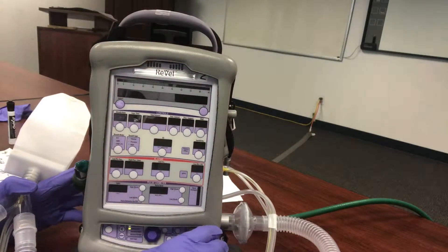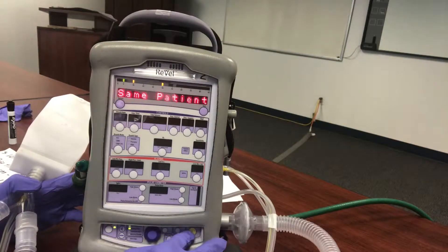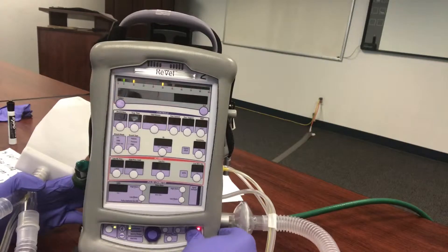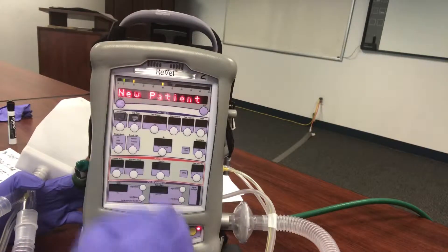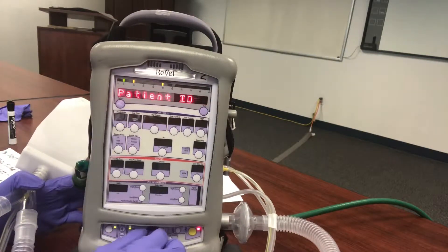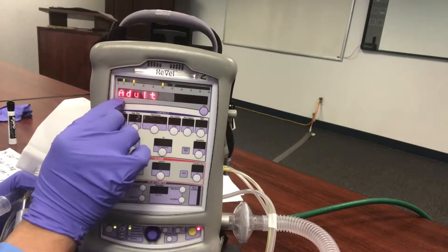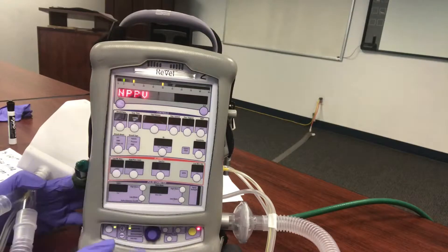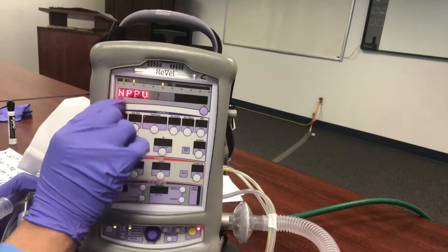Turn it on. We're going to clear the alarms and then get a new patient. Skip patient ID, patient size — adult. We're going to skip intubated, scroll to NPPV, and select that.